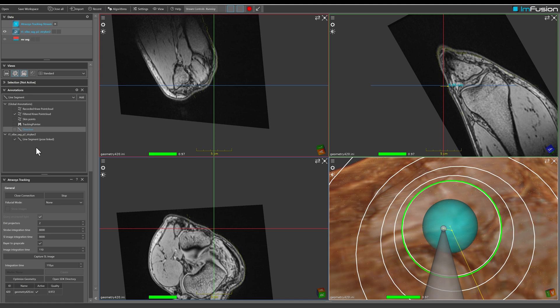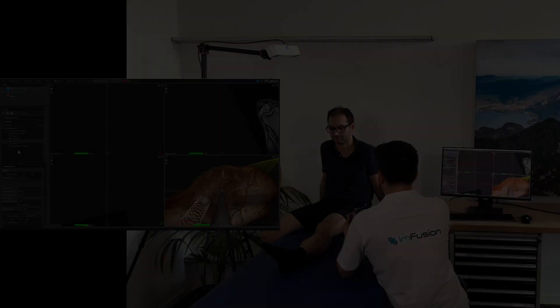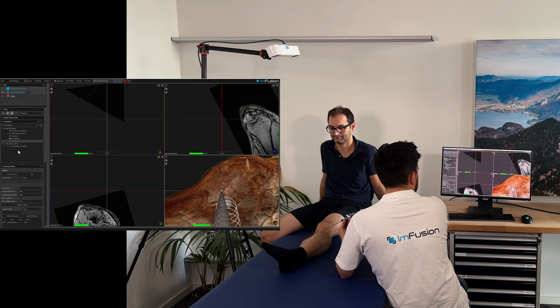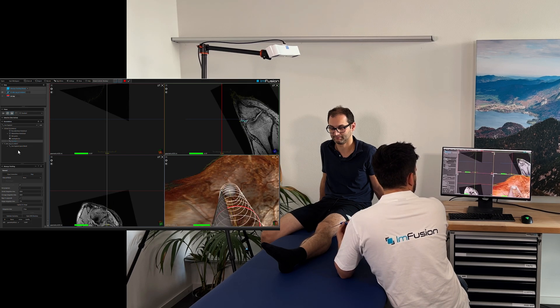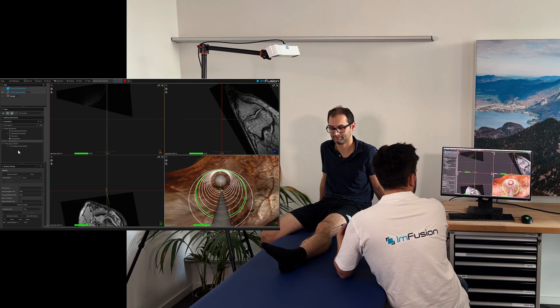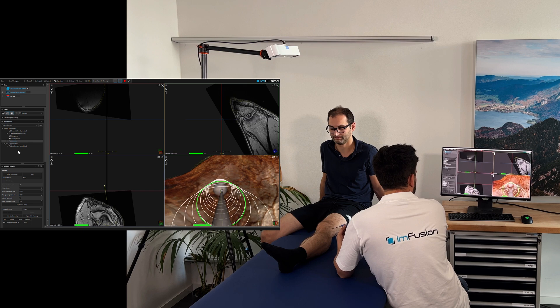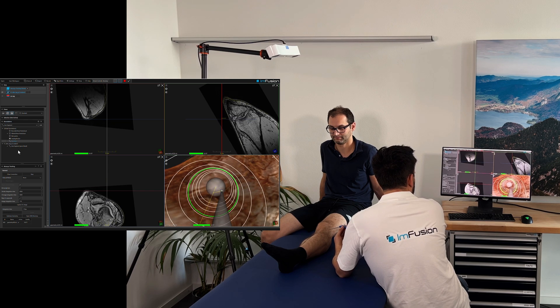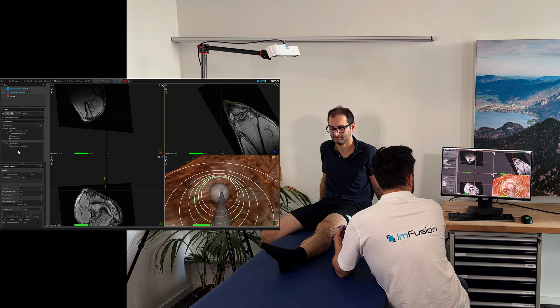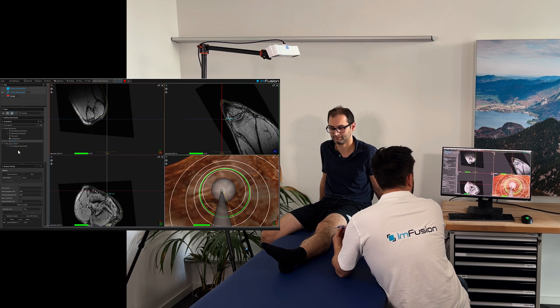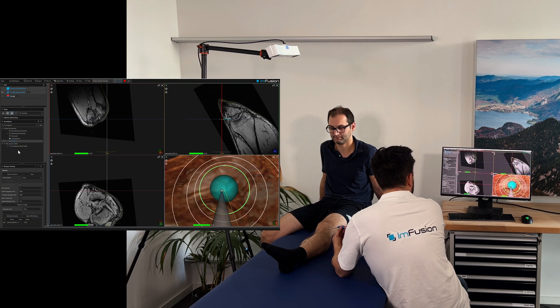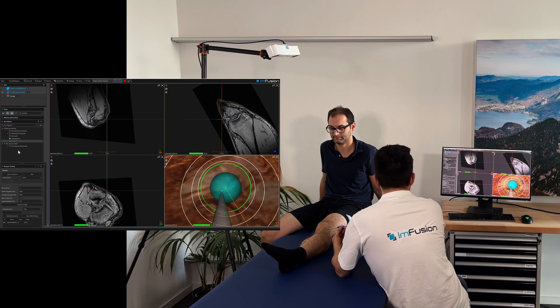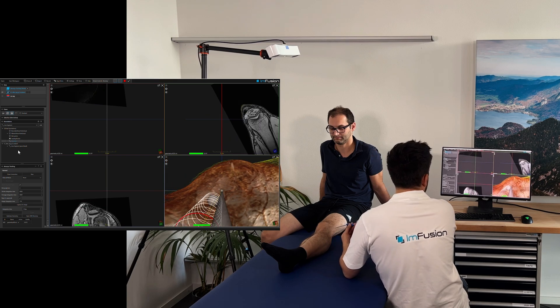Now for the final part of the demo, let's use the registration to navigate to our predefined target point. The user is navigating a pointer based on the visualisation shown on screen. The pointer needs to be aligned to the rings and hit the grey sphere. With this we have now successfully navigated to the target point.